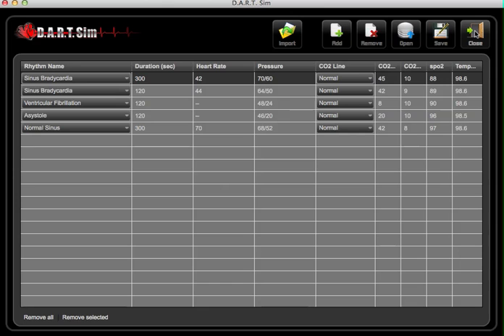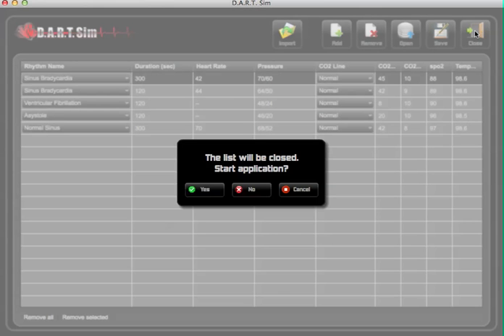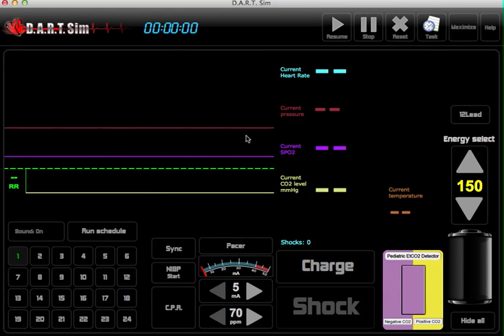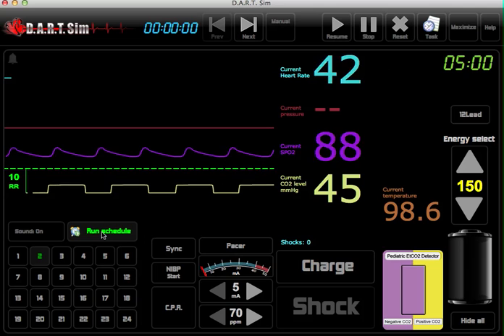So if we're going to run this scenario, we'll go ahead and close. It gives you the option to start the scenario now or later. I always just click on no so you can always reset, start from the beginning, and then read off the scenario to your student. And then once ready, you can run the schedule.